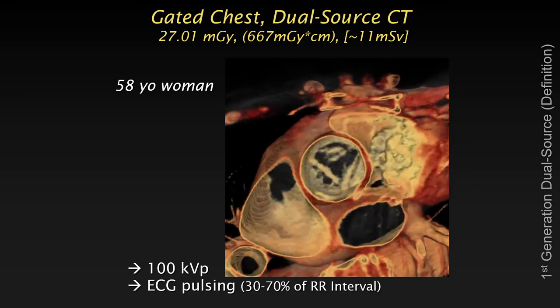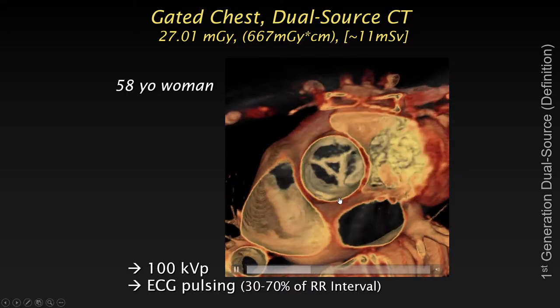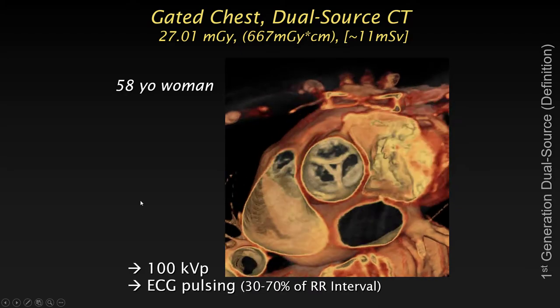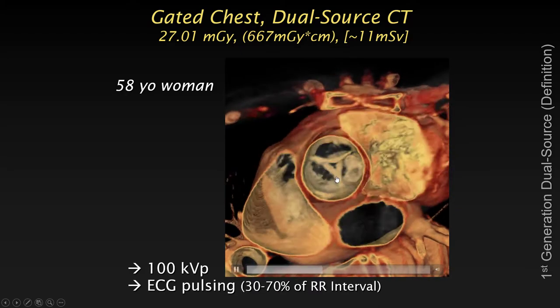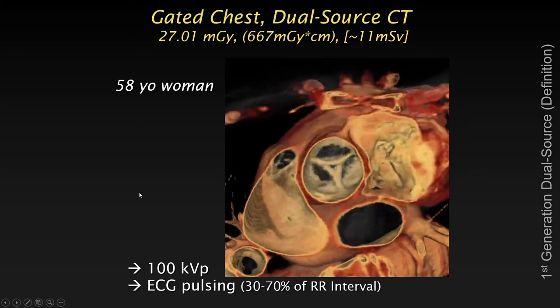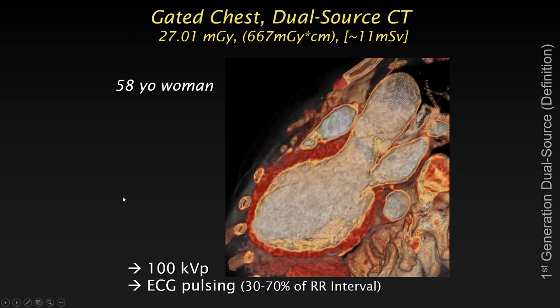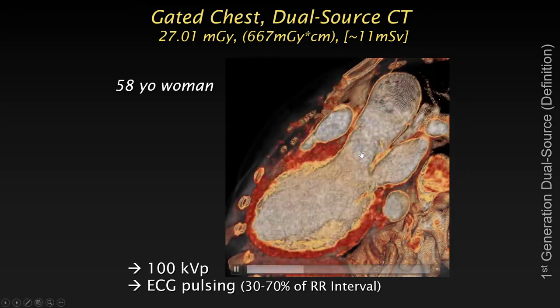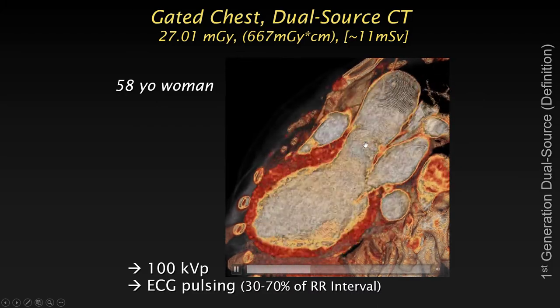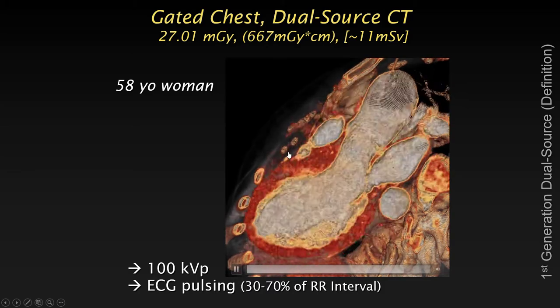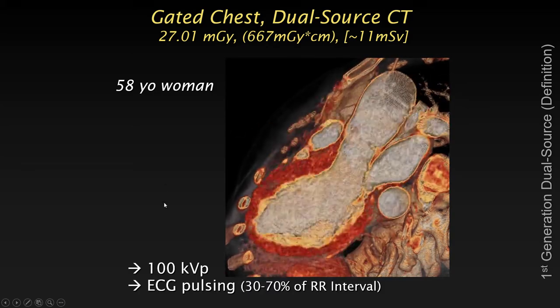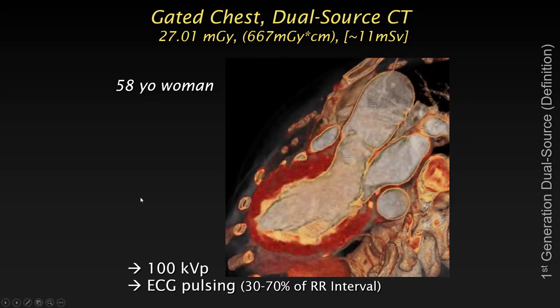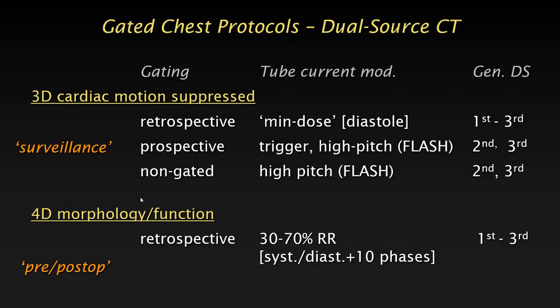Even when down-modulating to 20% during systole, during diastole the images are sharper. You can see how the valve opens and closes, see clearly that the valve is thickened, and also that the valve doesn't coapt — there's a coaptation defect in the center. On the three-chamber reformat, you can see the valve doesn't completely close in diastole, so blood comes back, which is why the left ventricle is relatively large and volume overloaded from contrast returning from the aorta during diastole.